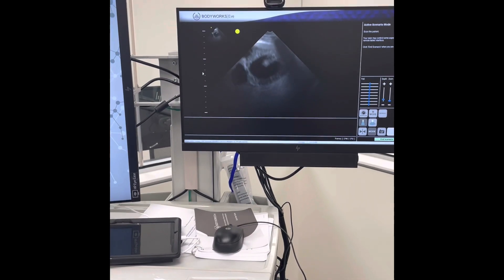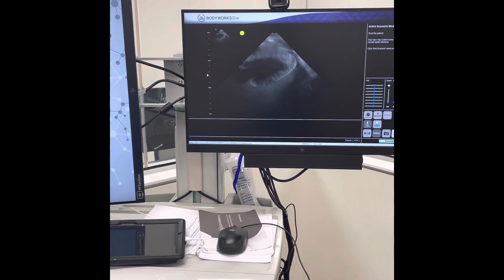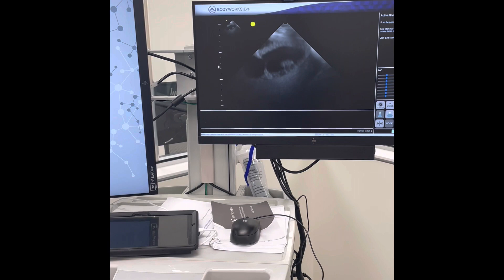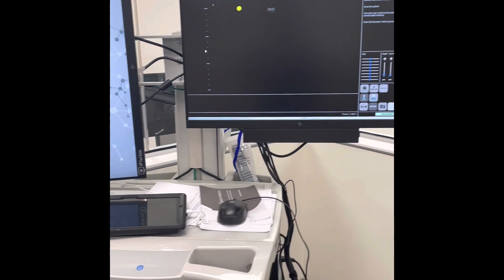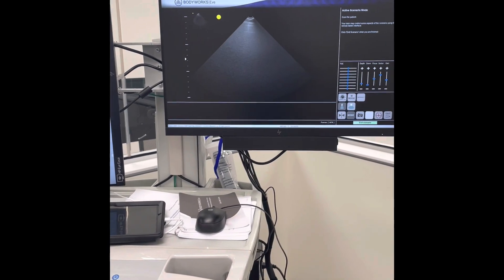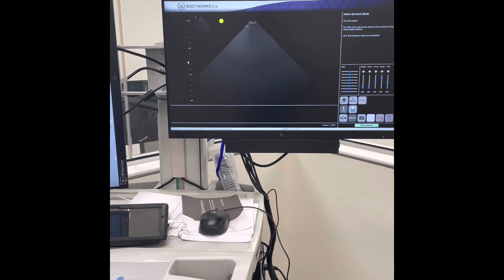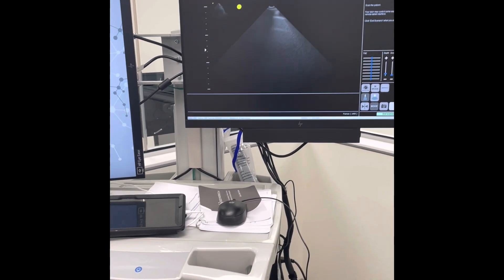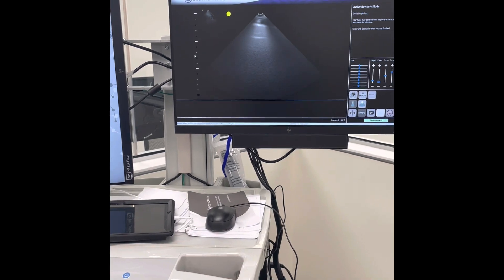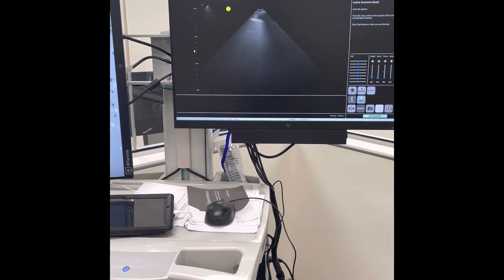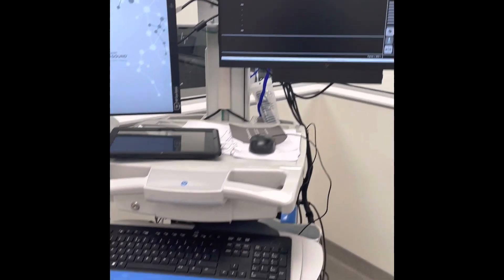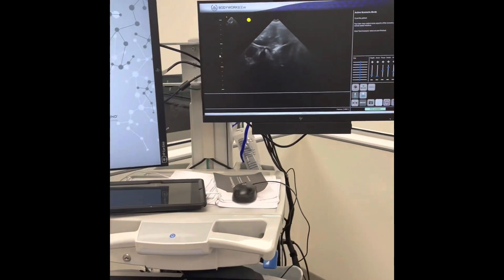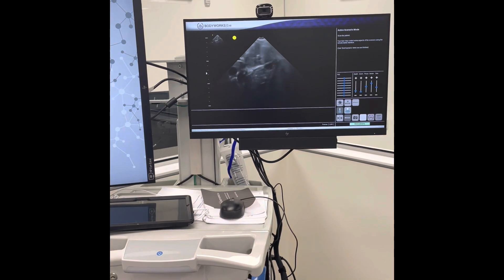This is a parasternal view of the heart that I am getting right now. But I could easily do Maya's lungs, and not only that, I could do a subcostal view for Maya.